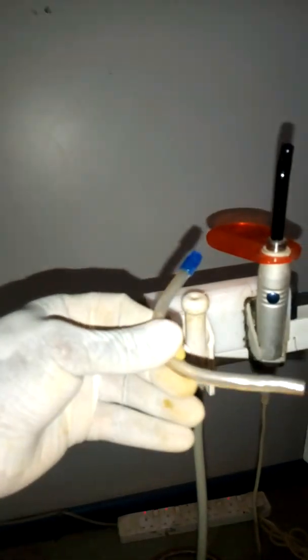Hello guys, today I want us to look at the suction system of the dentistry I fabricated a few months back. This is a suction tip — it is usually detachable and disposable. Whenever someone is being worked on, this one can always be changed.